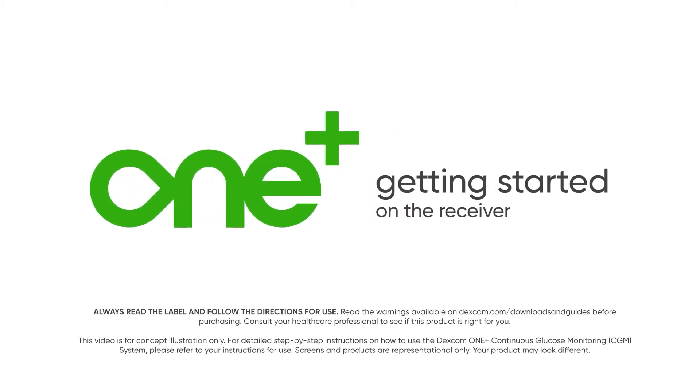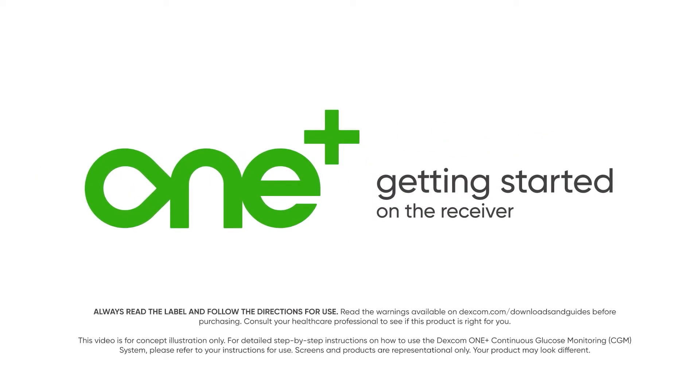Getting started with the Dexcom One Plus receiver is easy. Paul has just received his system. Let's watch him get it set up.